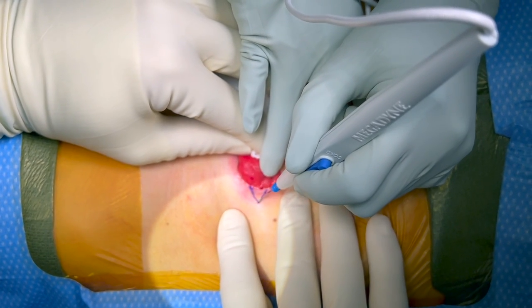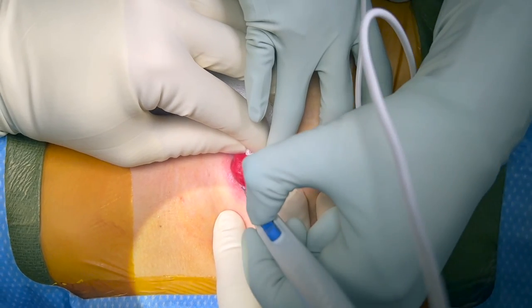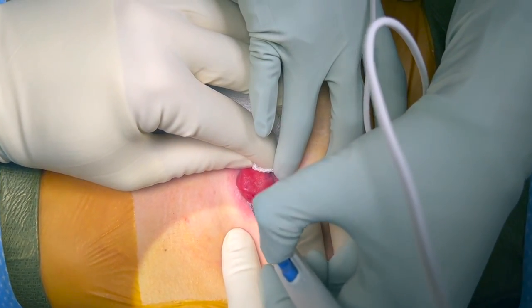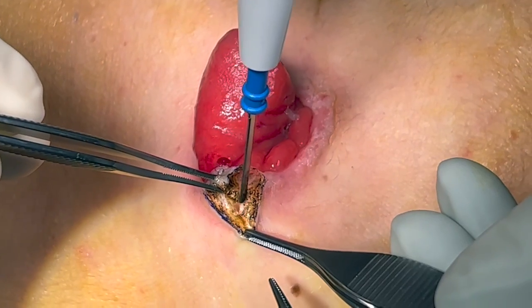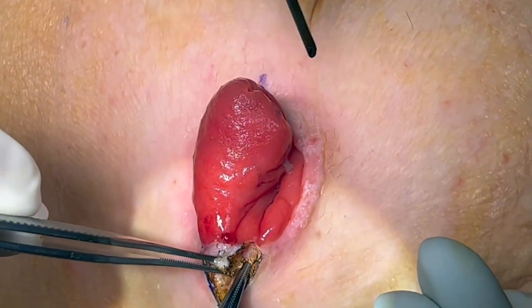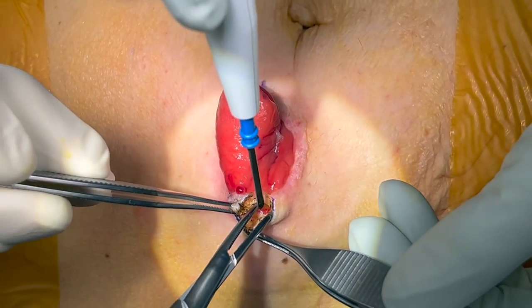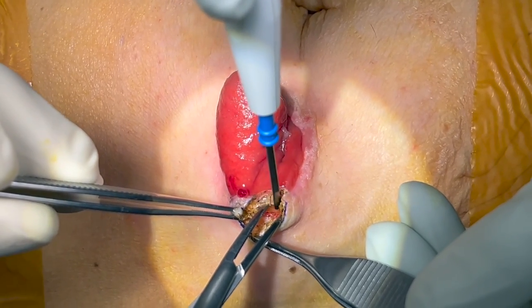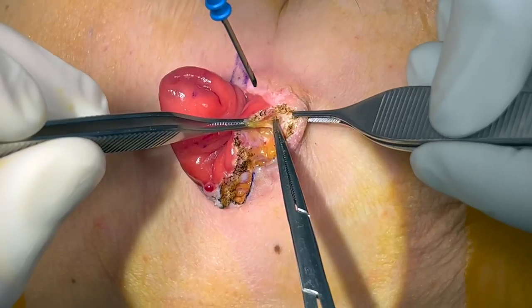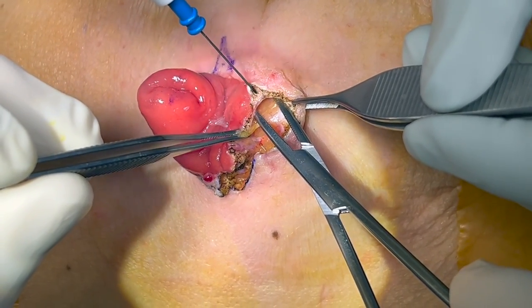We start our procedure by marking an elliptical circumferential incision around the stoma site. The insert shows a diagram representing the marking around the ileostomy. The mucocutaneous junction is incised using electrocautery. Alternatively, a scalpel can be used to make the circumferential incision. Then we take down our dissection until the subcutaneous fat is identified.